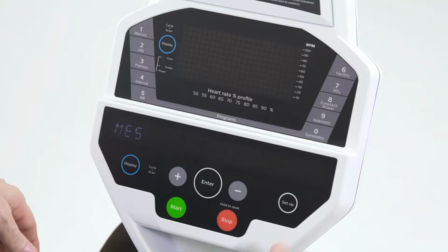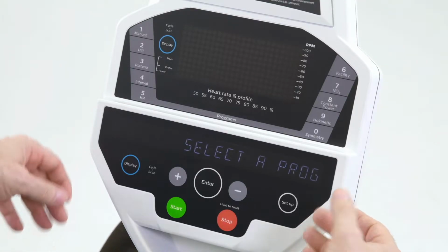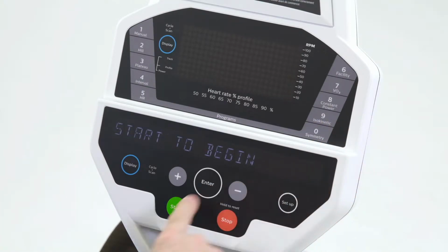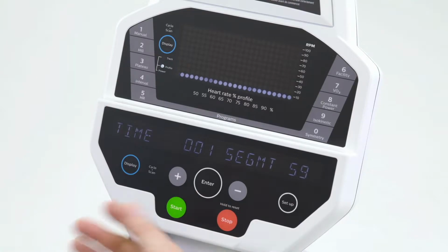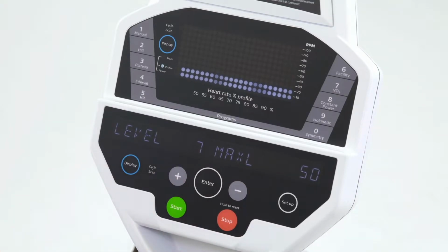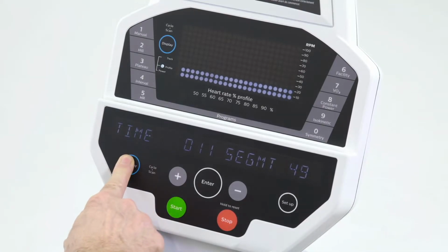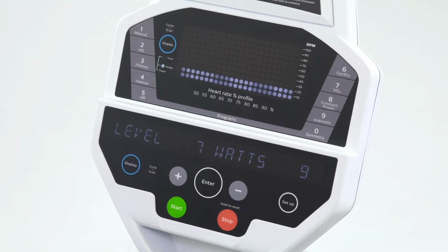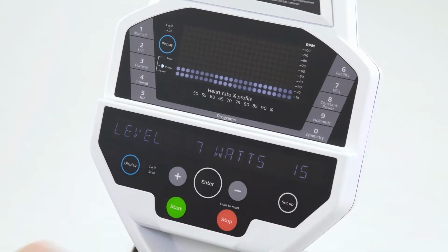We'll discuss the functions of the control panel for the bike. We have many different functions that we're able to do inside the console. We have 3 different resistance modes. If we just press start from the beginning as a quick start, the resistance mode we get is a constant resistance, which means the resistance level is set at a constant rate, and the power will be determined by how fast the patient pedals. So the faster they pedal, the more watts they would do.